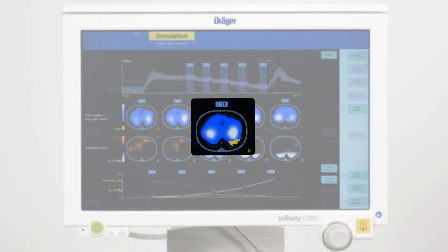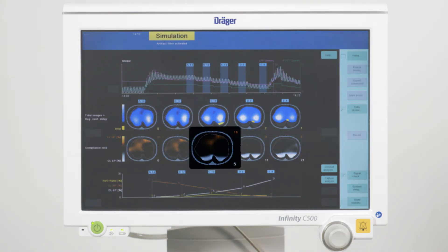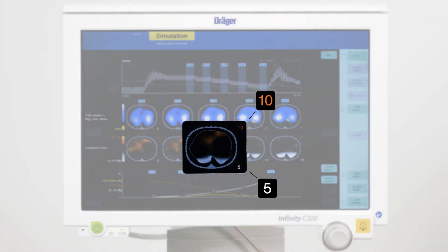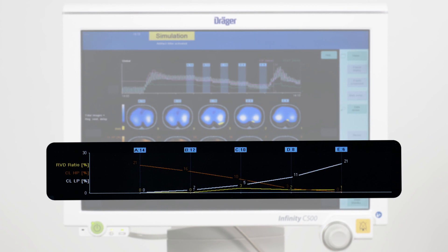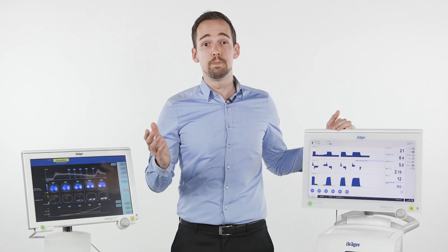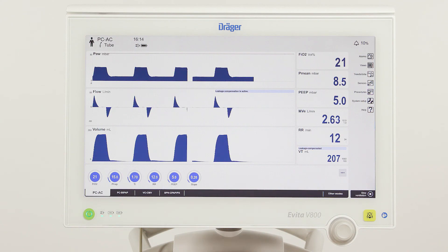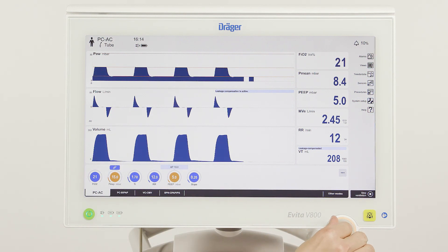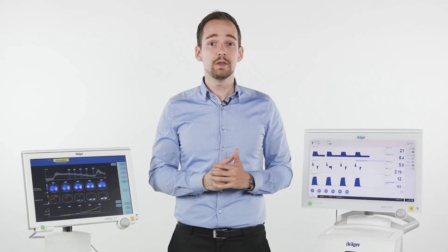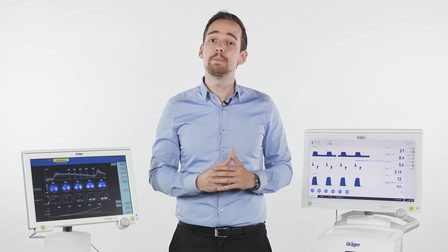The yellow color indicates regions with cyclic opening and closing. Next to the maps of compliance loss, the associated parameters also allow a quantification of those conditions. In the diagram displayed at the bottom of this diagnostic view, we can observe an opposing trend of collapse and overdistension, with a clear intersection at a certain PEEP level. To personalize PEEP selection, we could choose this or the next higher PEEP level, as this level shows the minimal amount of total compliance loss. The final decision, of course, depends on multiple parameters and the overall patient condition.